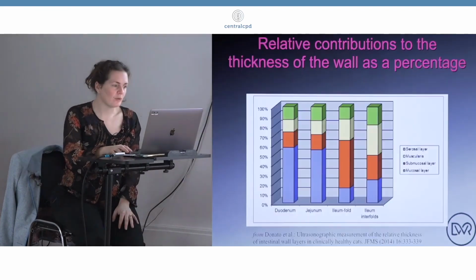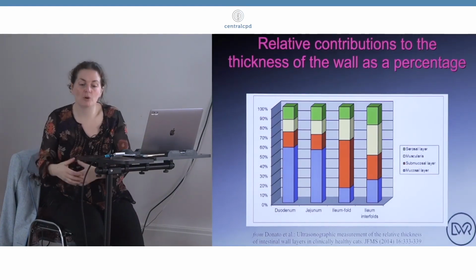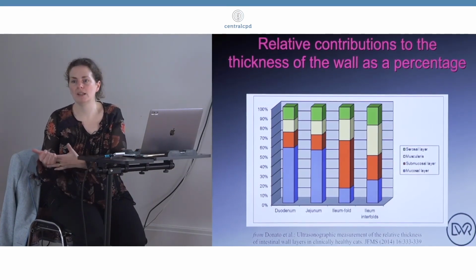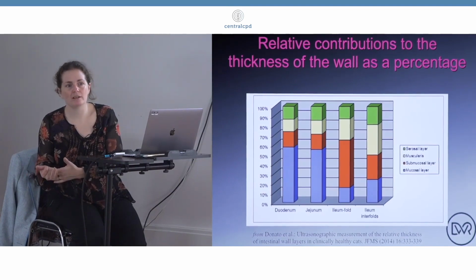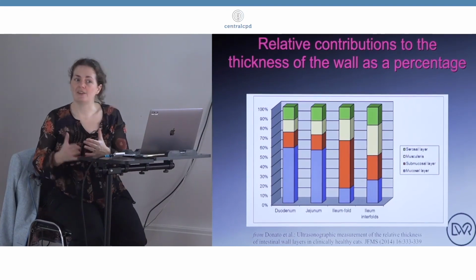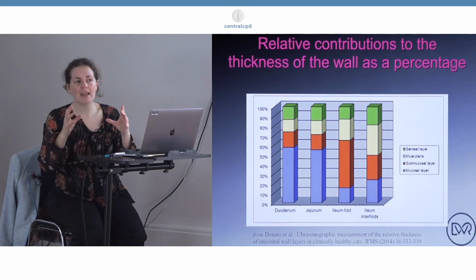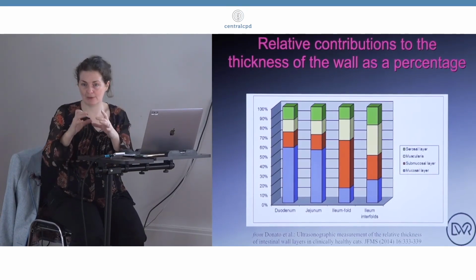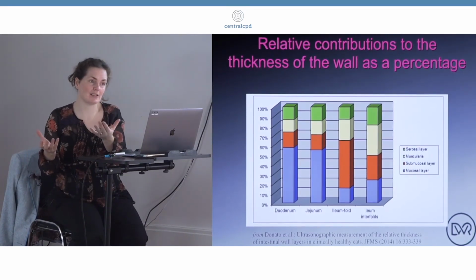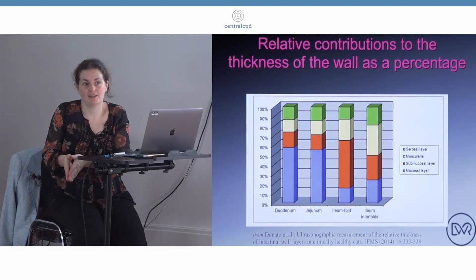Several people have looked at all of these things, and there is sometimes more expectation of seeing lymphadenopathy with lymphoma, but you can see lymphadenopathy with some of the inflammatory conditions as well. There is some thought that with lymphoma, maybe the muscularis thickening would be greater, and there's so much overlap between the patterns that unfortunately we can't rely on that either. In the main, if you look at a population of cats, the IBD ones will be slightly less affected than the population of cats with eosinophilic enteritis and with lymphoma. But in your individual cat, there is no way of using that data to say.